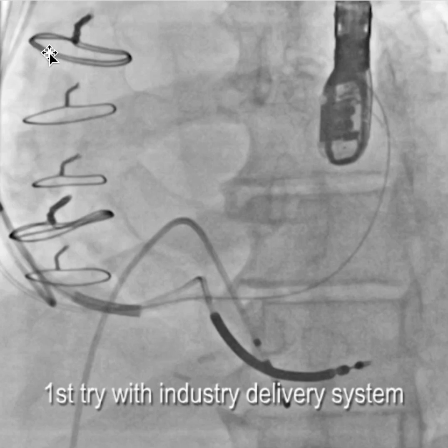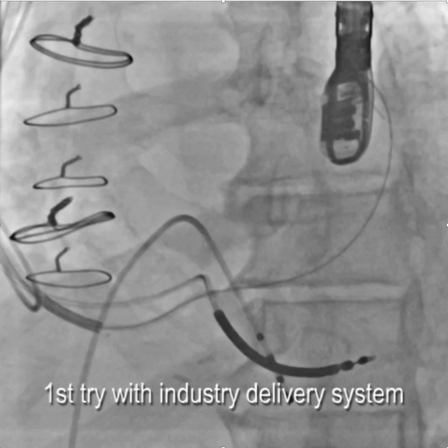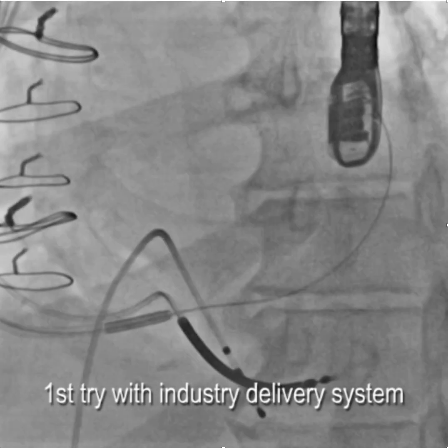This is a typical situation I see fairly frequently — a previously failed implant where the industry sheath gets to right here, you get a wire into what you presume is the coronary sinus, and you just can't manage to get decent support or get into the coronary sinus.